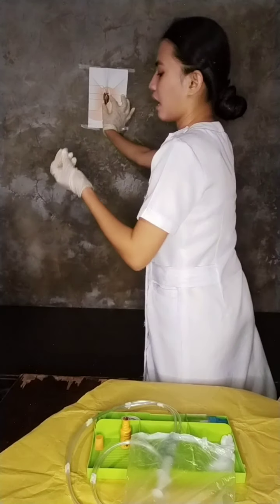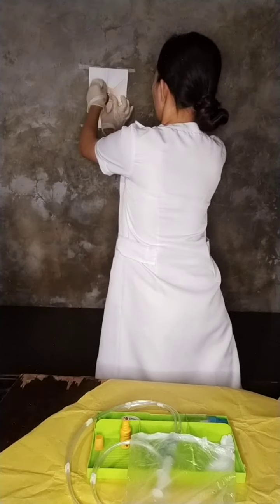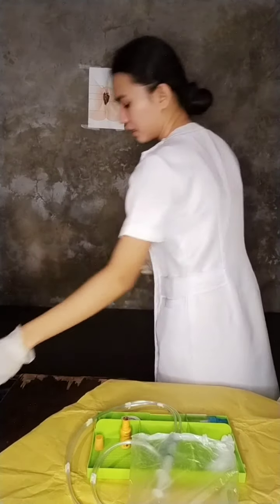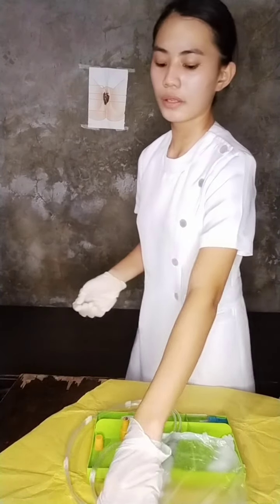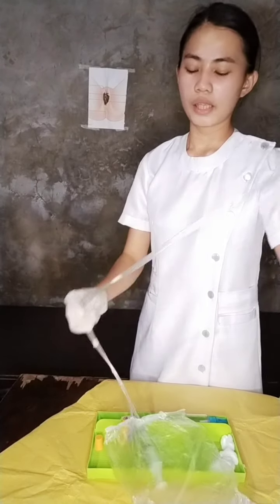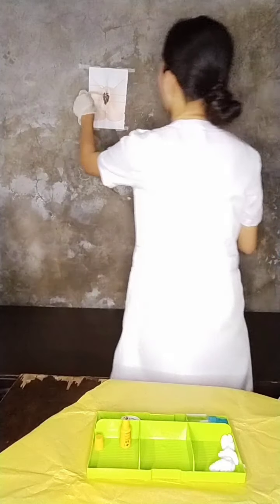Next is the middle of the labia, which is the meatus, and then discard it. And then after doing perineal care, you can now insert the catheter into the urethra of your patient.